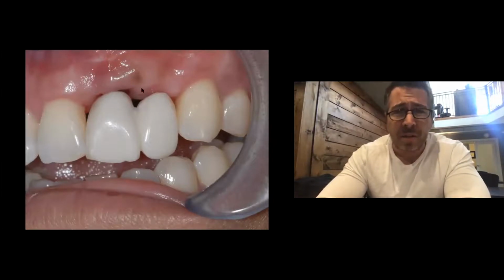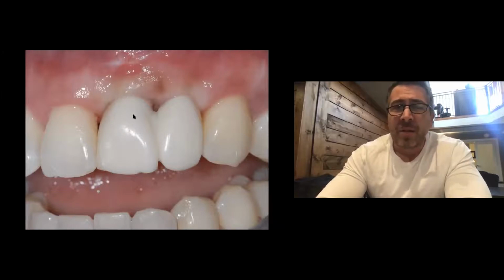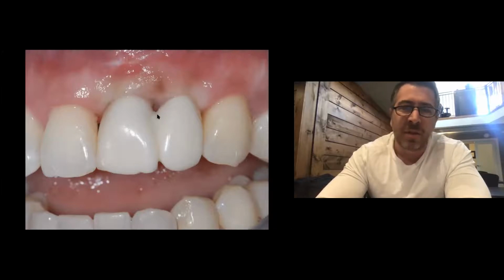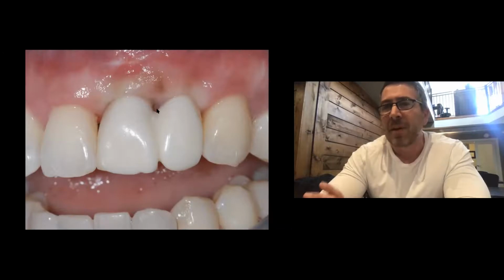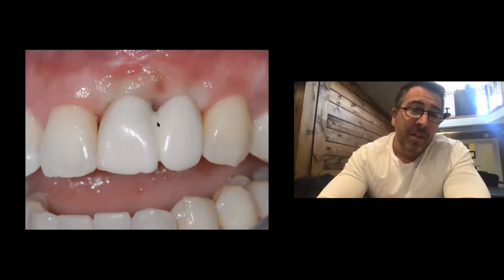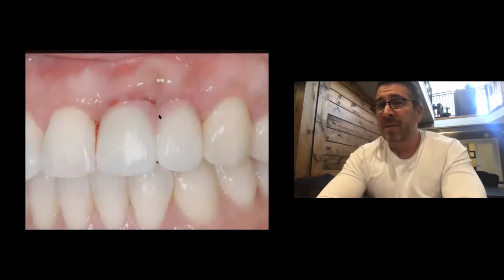We start to try and sculpt our soft tissue and see what we're going to get before we actually order our final prosthetic. So I can start to tell her, you wear this for a couple months, we'll take a look at it, we'll look at your soft tissue profile, but I know here I'm already getting a long contact. And that was predictable from the beginning because of my understanding of vertical height from bone to contact point. So now I look at that and say, okay, am I planning on placing 2 implants here? If I place 2 implants here, I'm gonna have an even bigger problem with the embrasure. So that's why we placed the single.